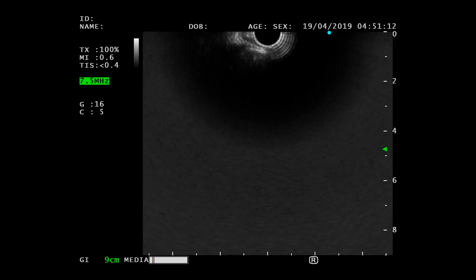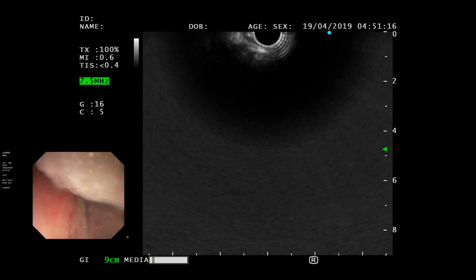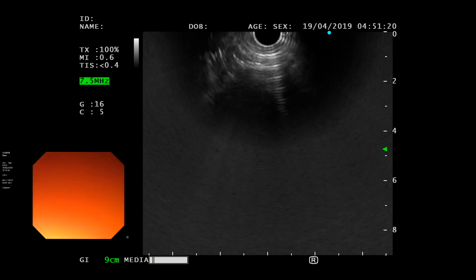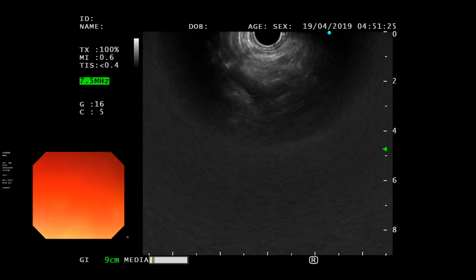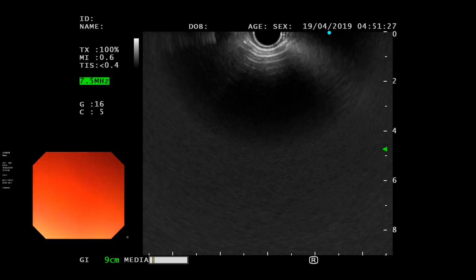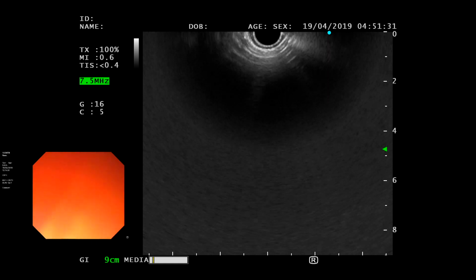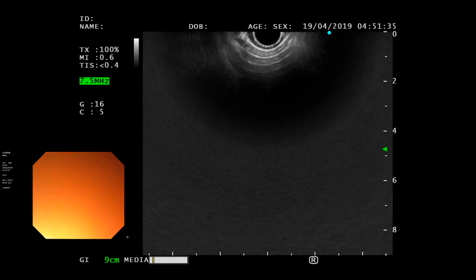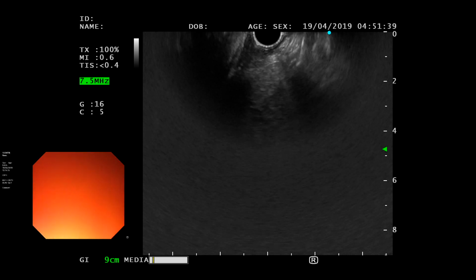So what we want to look at is the distal bile duct because there was a stricture, and we therefore want to assess if there's anything in the pancreas when we're in the distal bile duct, or maybe even the duodenum. Farooq, in a situation like this, do you generally start in the usual place and then eventually get to your target area, or do you go to your target area first and then complete your exam?